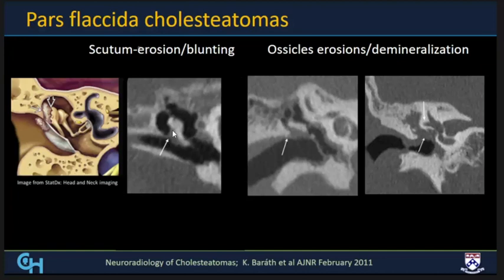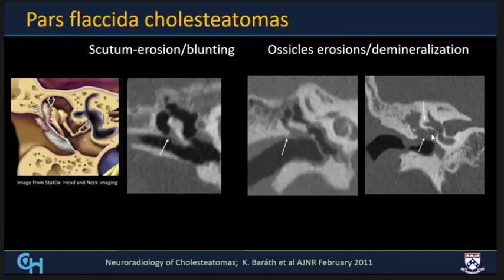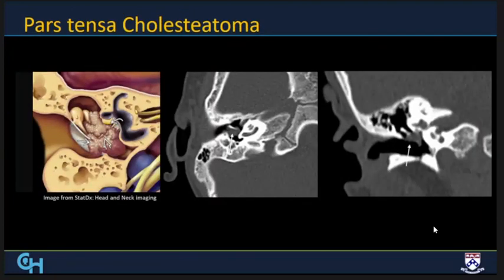Three cases of varying sizes of pars flaccida cholesteatomas: a small one just beginning to encroach the Prussak space with a sharp, pointed scutum; a larger one with near effacement of the Prussak space and blunting of the scutum; and a large soft tissue mass almost completely opacifying the middle ear cavity and encasing the ossicles. In these cases, check the sinus tympani involvement, the bony covering of the lateral semicircular canal, the facial nerve canal, and integrity of the tegmen tympani.